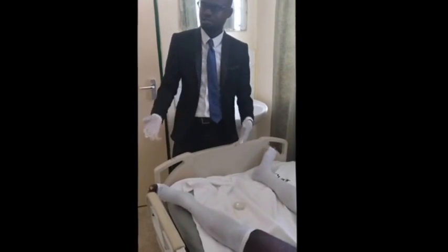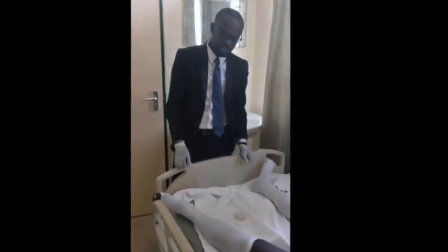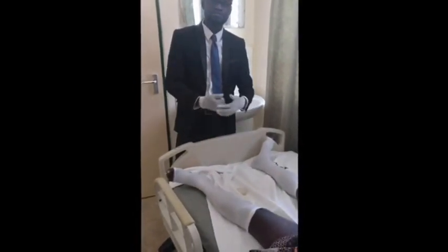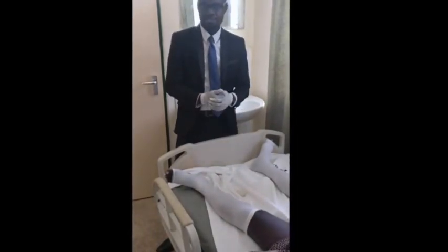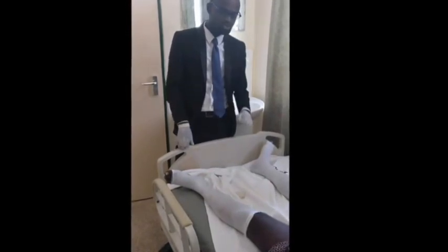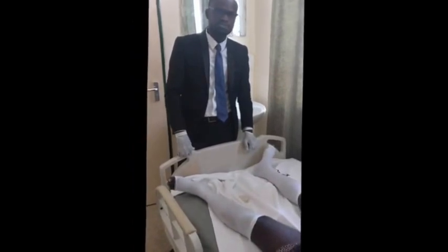We also need to explain to the caregivers about managing the stockings. They should take very good care of the stockings, make sure they are not soiled, clean them every 2 to 3 days, and again, as I said, make sure you don't take the stockings off for more than 30 minutes.